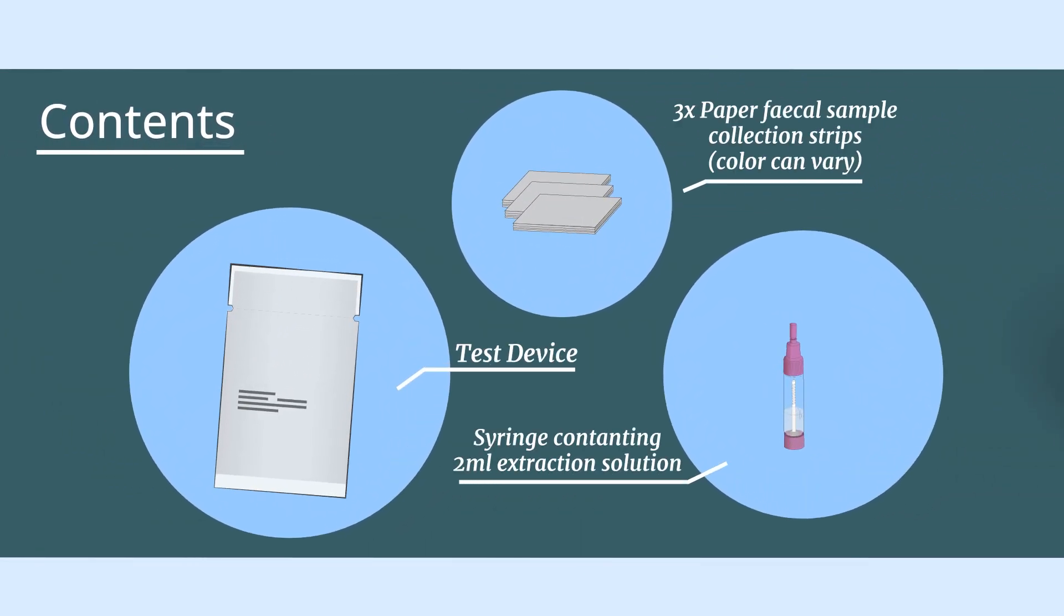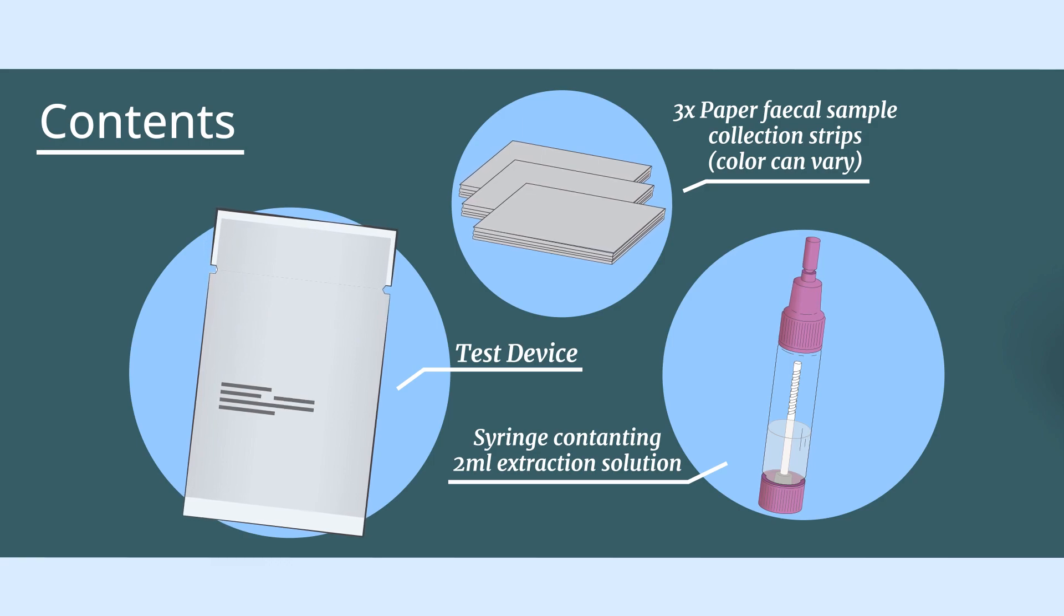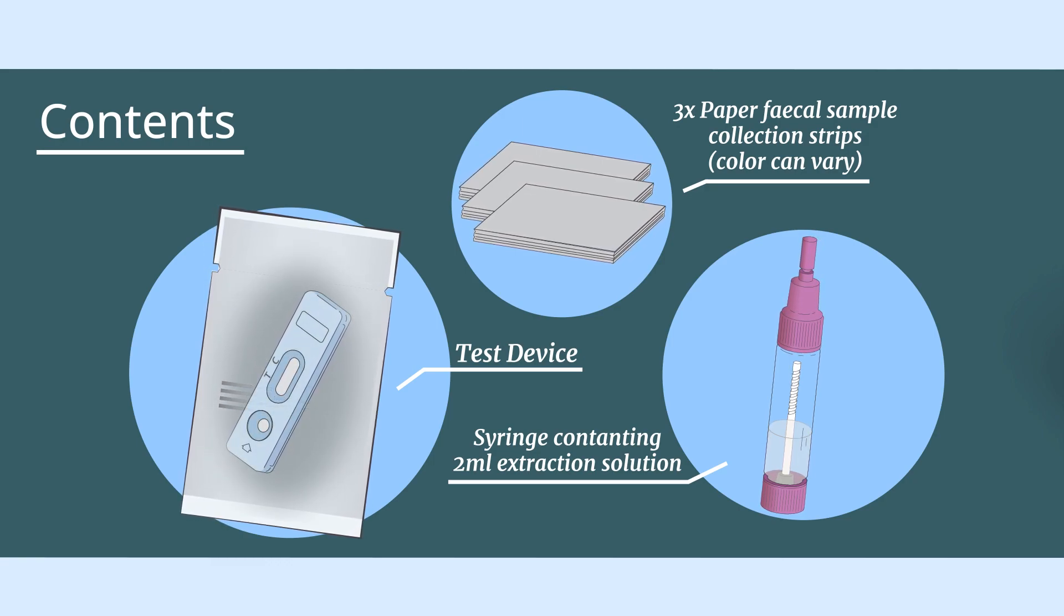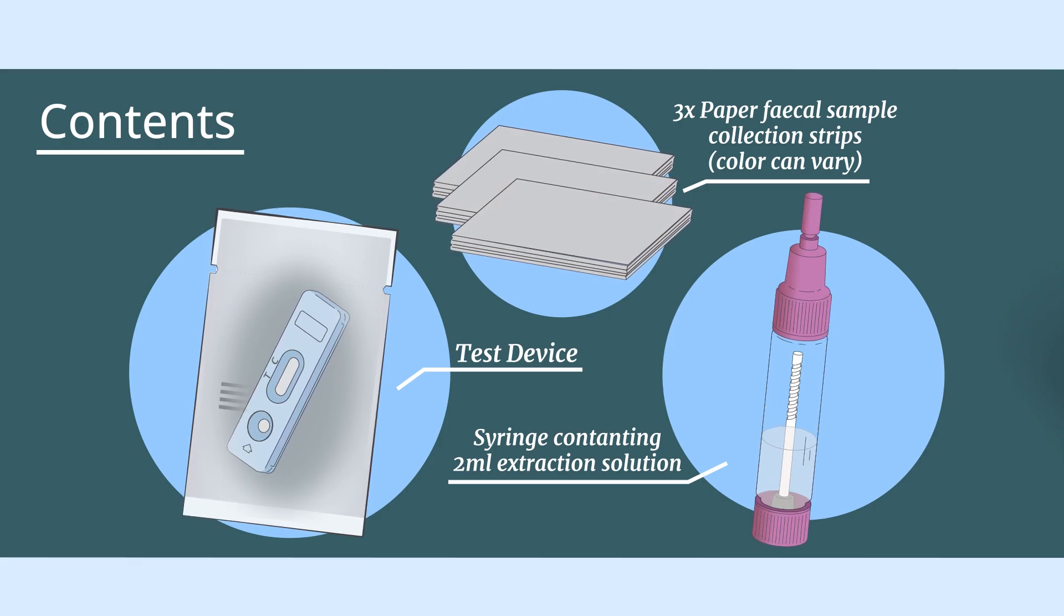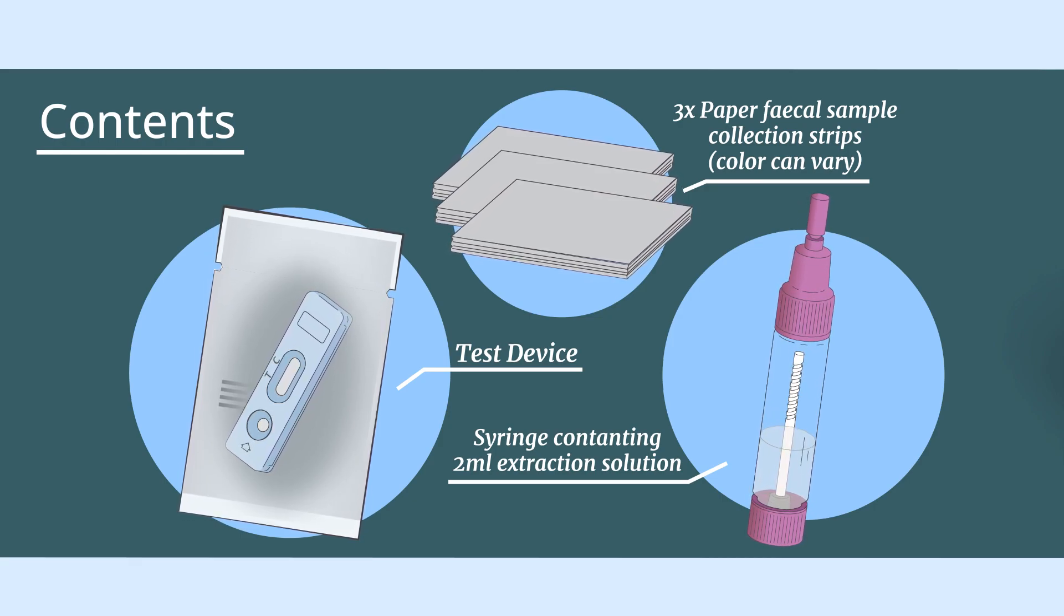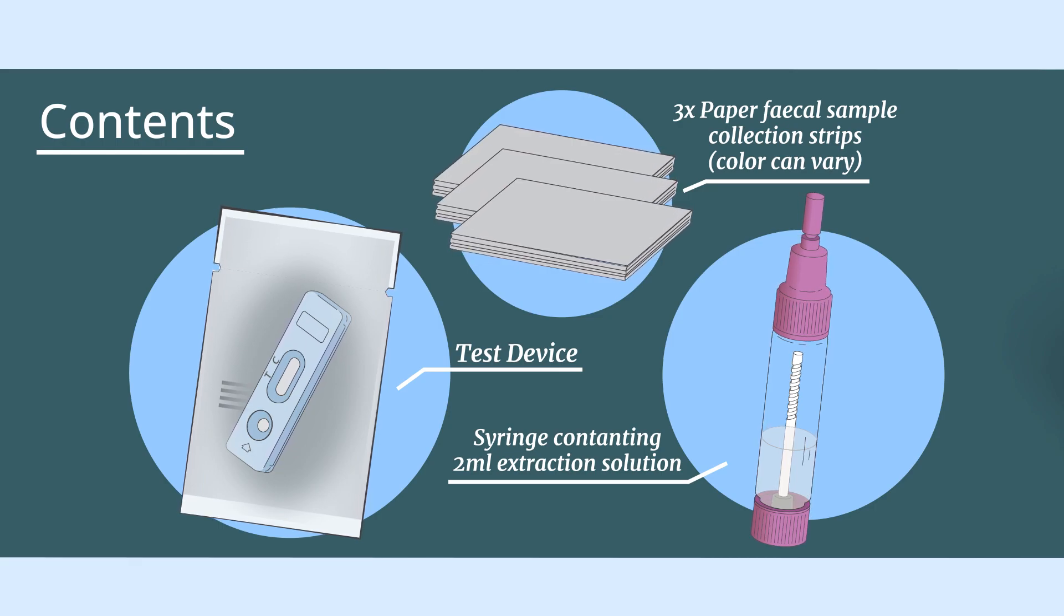What is inside the box? One sealed aluminum pouch containing one test device. The test should remain in the sealed pouch until use. Three paper fecal sample collection strips. One syringe containing two milliliters of extraction solution in a protective plastic bag.